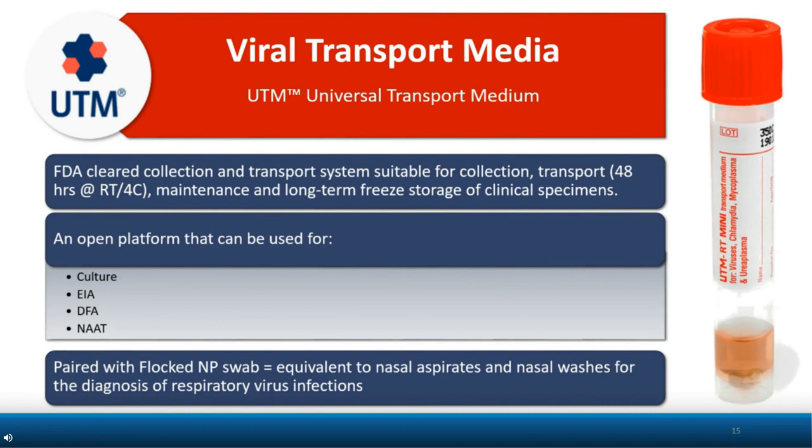Now, viral transport media is an open platform. This type of specimen collection can be used either for viral culture, for enzyme immunoassays, for direct fluorescent antibodies, and even for nucleic acid amplification tests or molecular tests. And numerous studies are out there that have shown that if you take a UTM, viral transport media, and pair it with a flocked nasopharyngeal swab, one of those mini-tip flocked nylon swabs, it is equivalent to nasal aspirates and nasal washes for the diagnosis of respiratory viral infections.